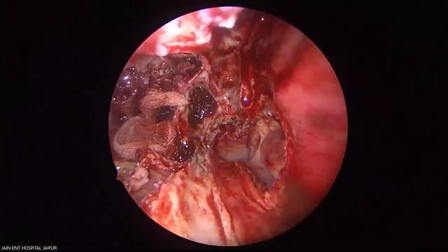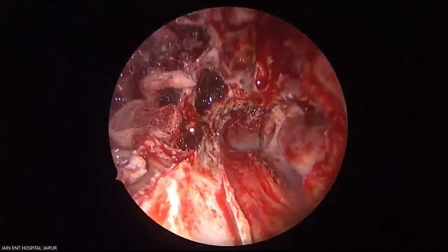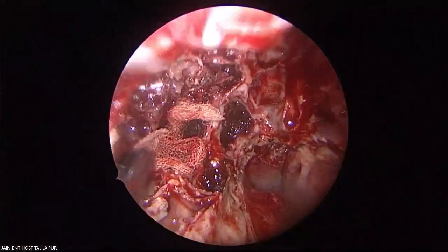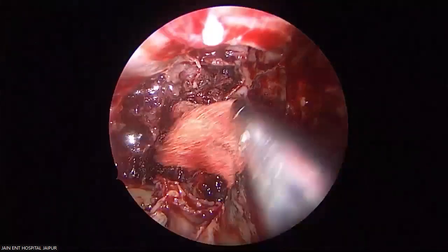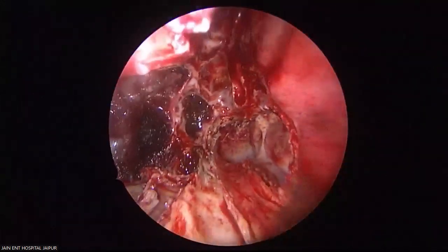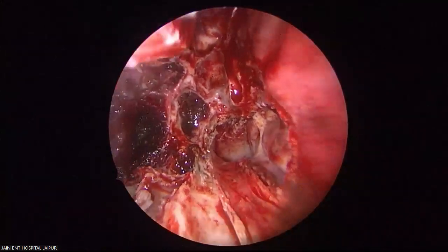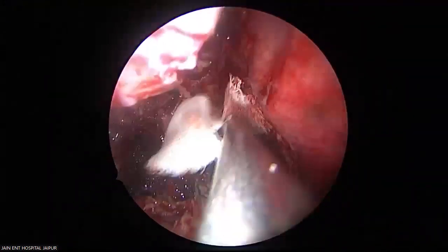This is how you can remove the juvenile nasopharyngeal angiofibroma, and we have not transfused any blood yet. Beautiful demonstration and beautiful clean.